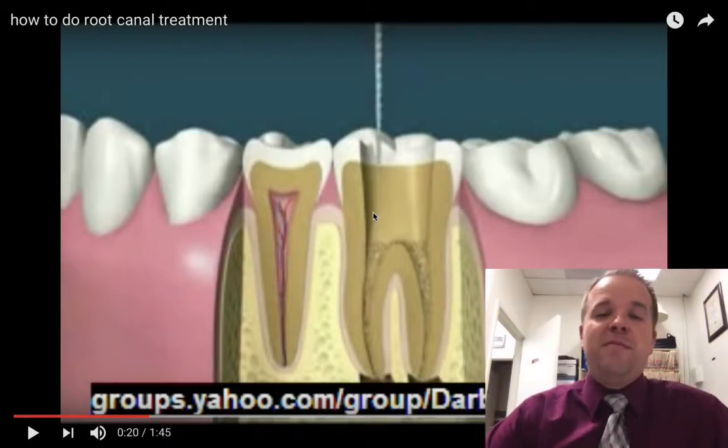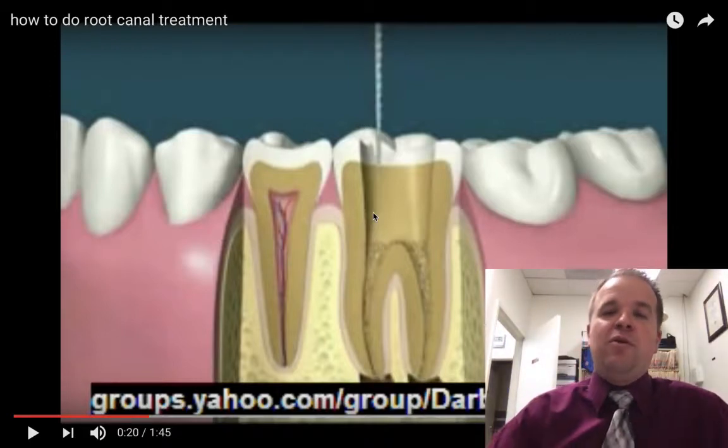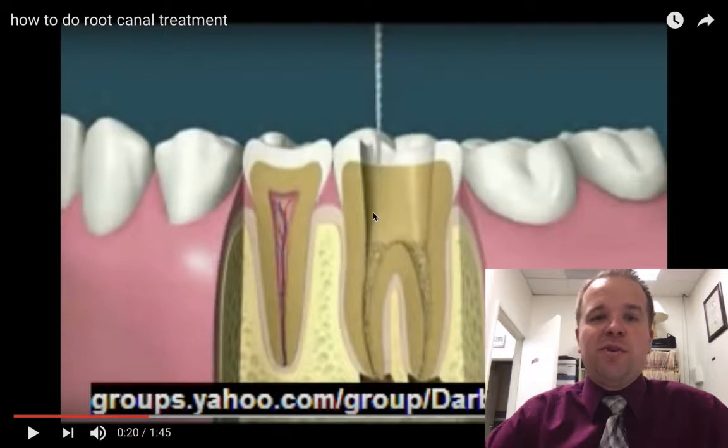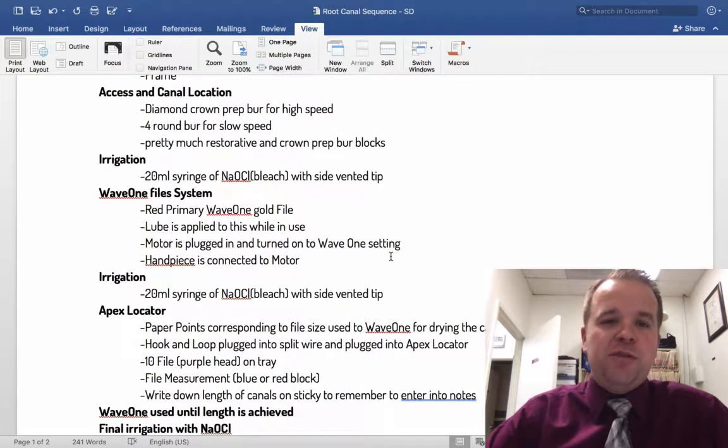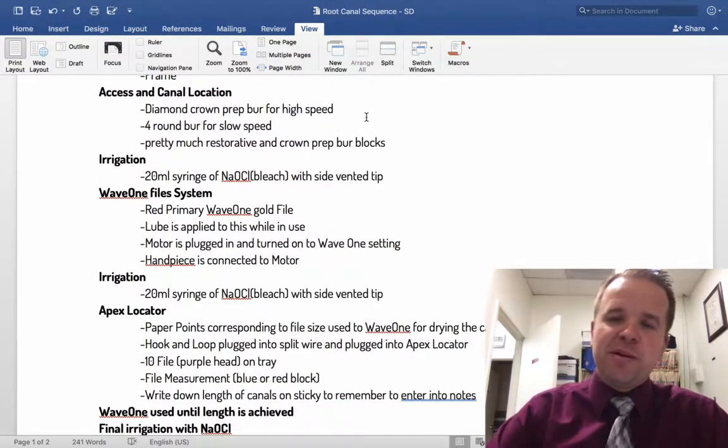So once you've done this, you've made the hole in the top of the tooth. Then this is where things start to get boring, and you access the different canals that are down inside the tooth. So once you've done that, in the high speed, you'll have a crown prep burr, which is typically what I like to use.